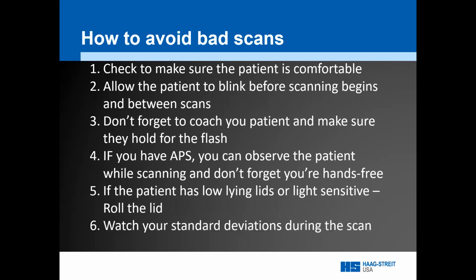Watch your standard deviations during the scan. This will help you to be prepared to focus on only those measurements that were variable and had high standard deviations. And in the manual mode, you can actually help the Lenstar stay centered on that visual axis while you're scanning and tracking it while the scanning's going on to increase your speed and improve the quality of your measurements.